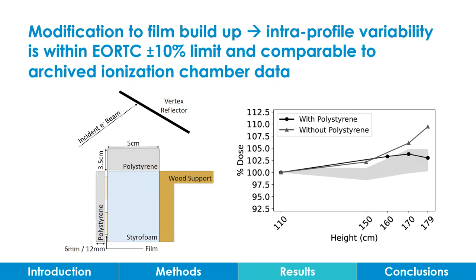We addressed this discrepancy by modifying the film buildup. This resulted in comparable intra-profile variability to the ionization chambers and agreement with the plus or minus 10% limit.